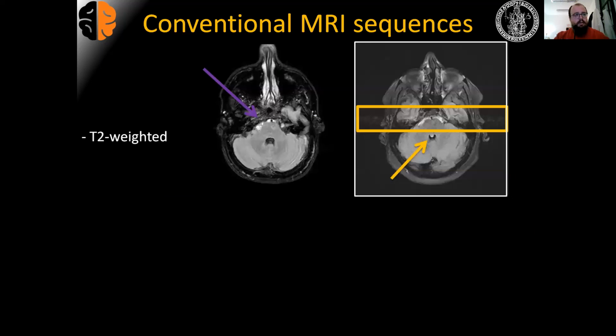And the answer actually is yes, because FLAIR sequences, which are very good to detect white matter lesions compared to standard T2, actually in the infratentorial compartment show some presence of artifacts, mainly related to not suppressed CSF signal, as you can see at the level here of the prepontine cisterns in the purple arrow, here also highlighted at the level of this image on the right, as well as in the fourth ventricle, where you can see this false, positive image, like there is something in the fourth ventricle, which actually is not. That's a flow artifact.